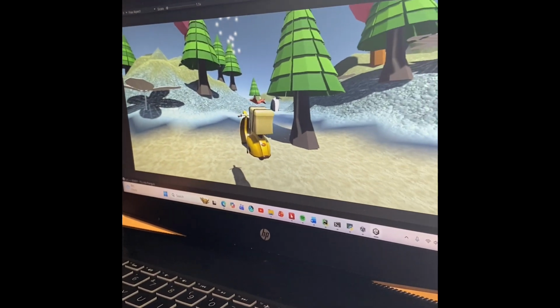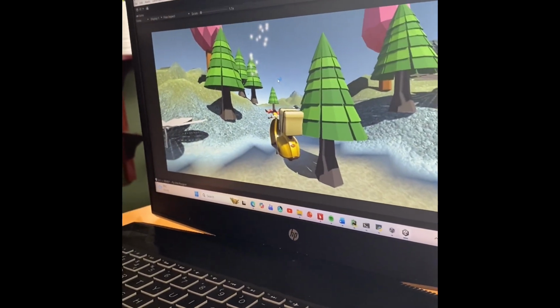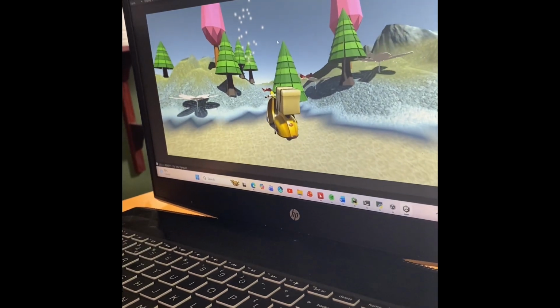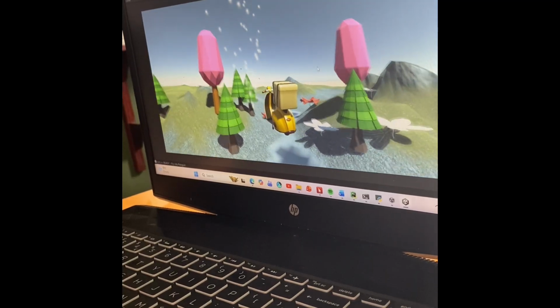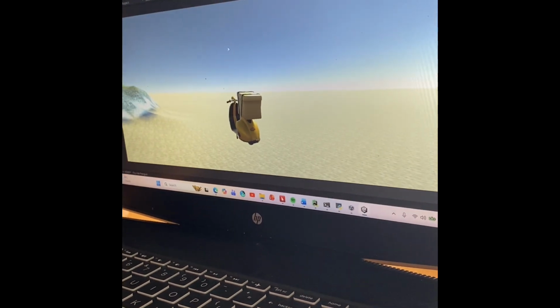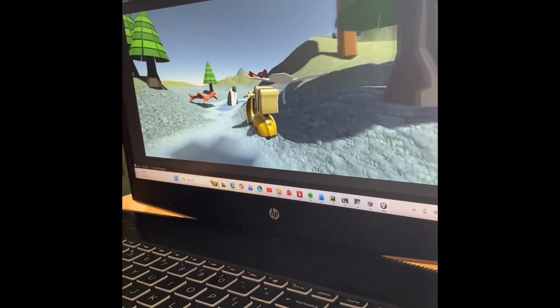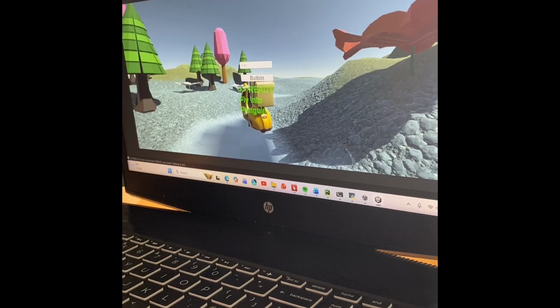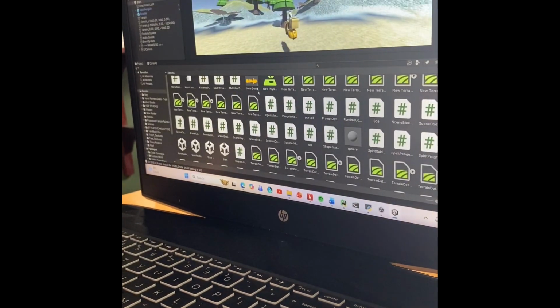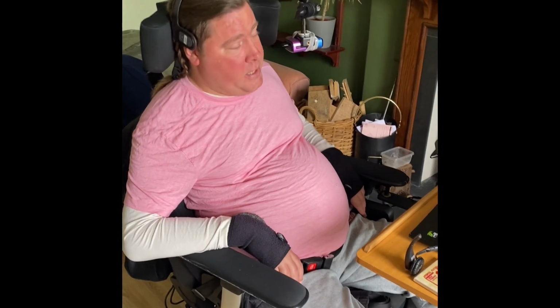So the way it's done is a little flick of the mouse. If I start in the middle of the screen and do a flick, I rise. A flick, I rise. A flick up, I fall. Flick, flick, rise, rise, flick, fall. So as you can see, I can fly. So one day this will map across to a drone, and let's see how easy it is to get to the penguin. Here we go, and up, down, there we go, we're at the penguin, and that's it. So that demonstrates the capability of using a head movement to fly an aerial mobility vehicle.